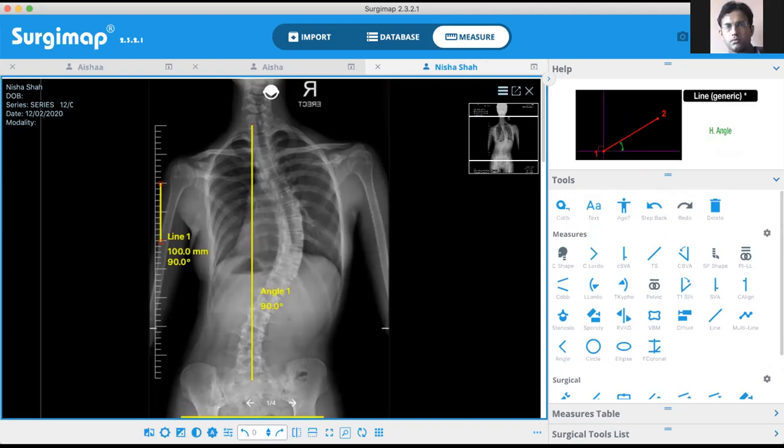The thing which is happening is that it's difficult to see those facet joints on the X-ray. The old concept was to do it perpendicular to the pelvis. That was the original description in the King paper. But the problem is that a lot of people have slight pelvic obliquities that are not consequential because of some amount of limb length discrepancy. Up to 2 centimeters of limb length discrepancy is generally ignored. It doesn't count towards deformity surgery planning.